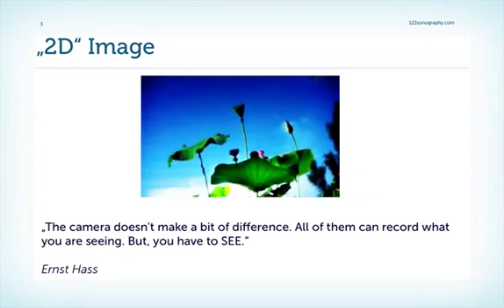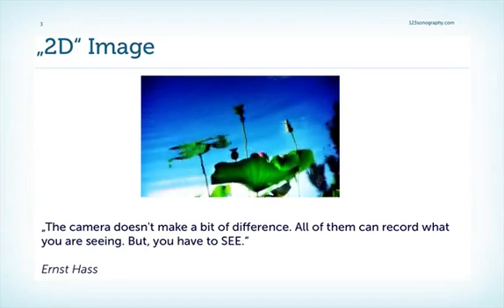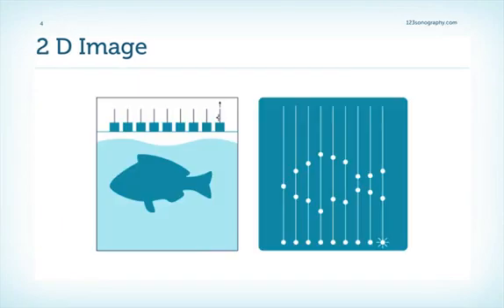two-dimensional imaging. "The camera doesn't make a bit of difference. All of them can record what you are seeing, but you have to see." This is a quote by Ernst Haas, who is one of the greatest photographers of all times, and it is also true for ultrasound. We'll be talking a lot about technical stuff and how images are created. But keep in mind that it is you, your experience, and your capabilities to interpret images which really makes a difference in the end.